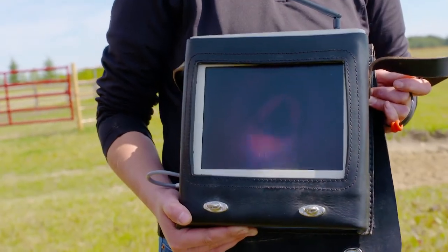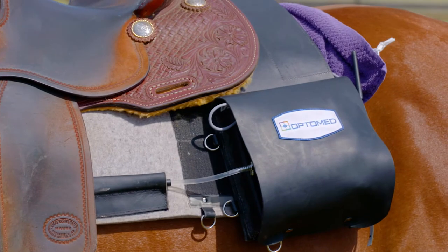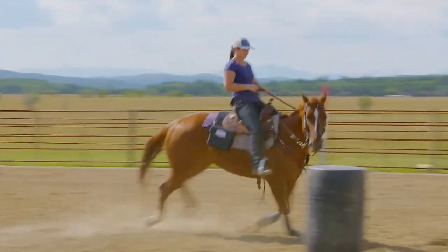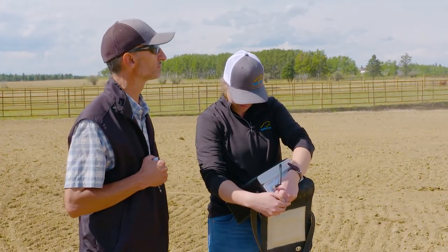We also have a screen, so there is a small antenna, and the device on the horse, on the pad, will send us the video on the side of the track. So from the side, we can see what's going on. I usually use a screen to monitor the position and make sure I have a good quality recording. But in all cases, I'm going to take the USB key with the recording, put it in my laptop back in the office, and then I'll review the videos in slow motion.